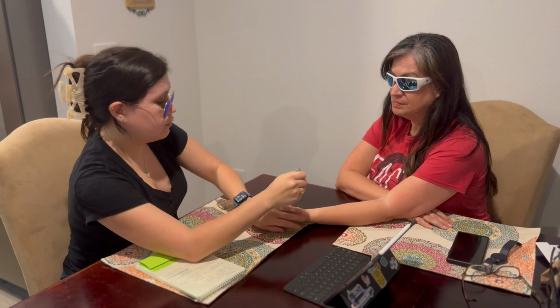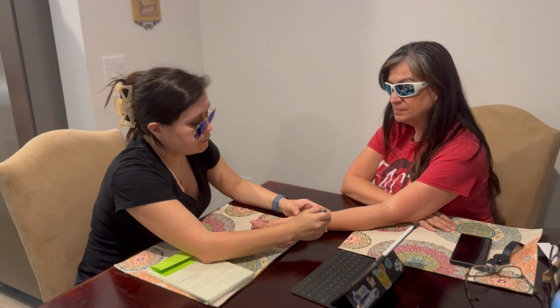All right, looks like we're about halfway, so we're gonna go ahead and rotate your wrist again, and then we'll start on this side.